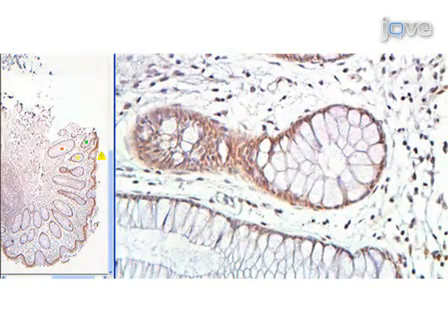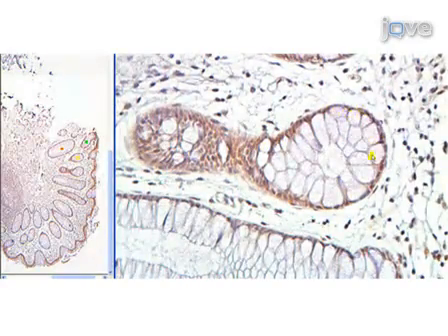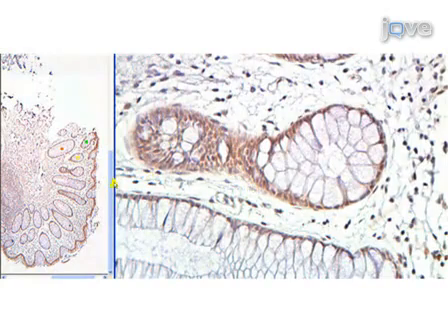This crypt exhibits both high expression on one edge and fairly high expression on this edge. And we place a green dot for overall level 3 expression.